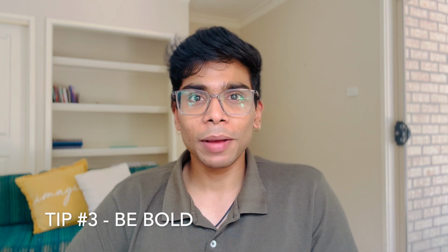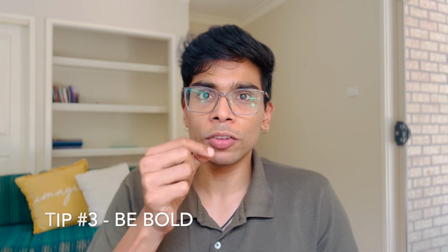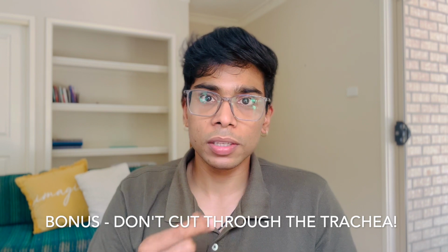Tip number 3 is be bold with your cuts. I remember the first time I did a cric, I freaked out and I started making these really small incisions on the skin, like 4, 5, 6 times, which weren't really doing anything. So something that my surgery colleagues love to say: cut like a surgeon. Be bold with your incision, but obviously do not cut through the trachea. Be bold enough to cut through the skin and the subcutaneous tissue. The front of neck is often tougher than what it looks.